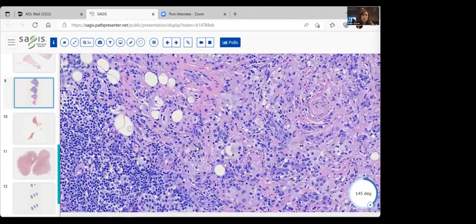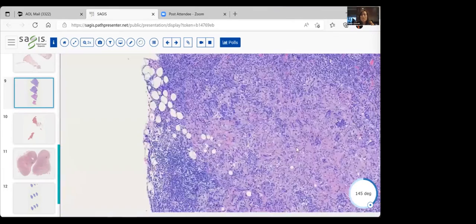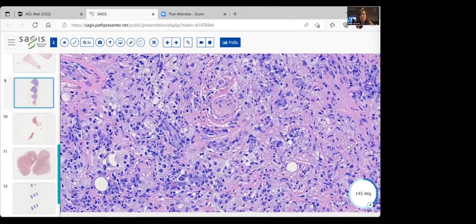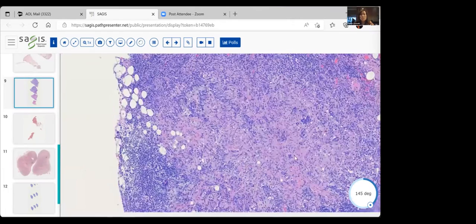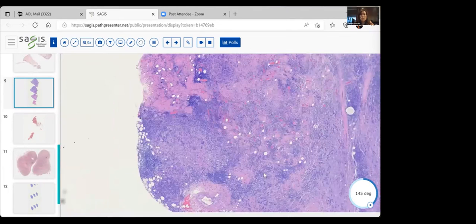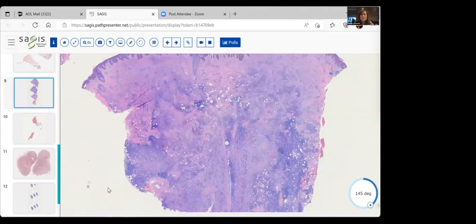Over here, just showing you lymphocytes. And that's what you see from afar, causing these darker areas. And then what you see causing these paler areas are these foamy histiocytes. Right. This is just another great example of Rosai-Dorfman. And I'm going to decrease the magnification to remind you that these are big nodules, right? It's just chock full of inflammatory cells. All right.